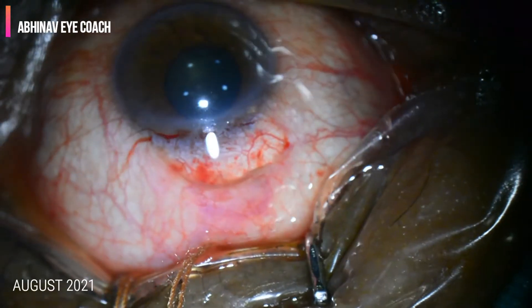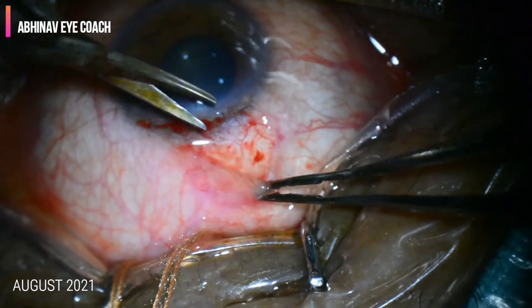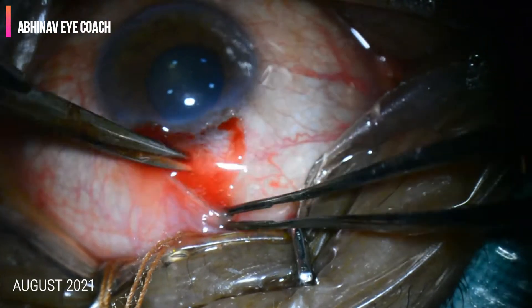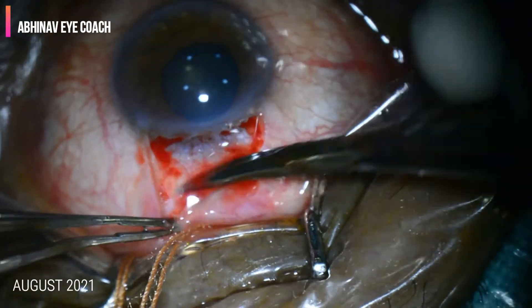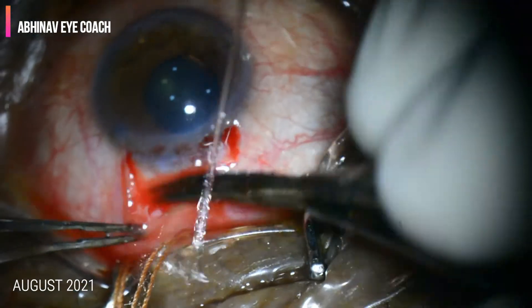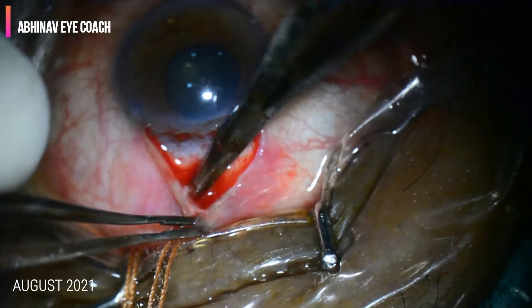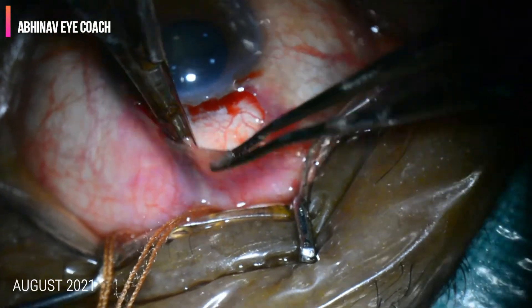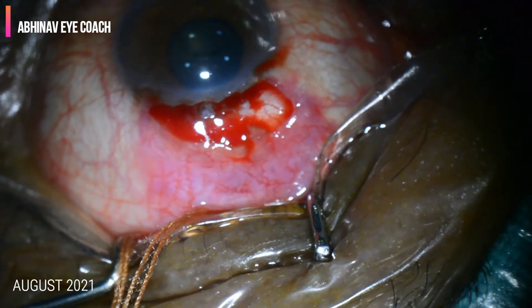Adequate exposure of the conjunctiva is achieved. The excess Tenon's capsule which is not separated from the sclera can be excised. A large space is created under the conjunctiva to place the Mitomycin C sponge.